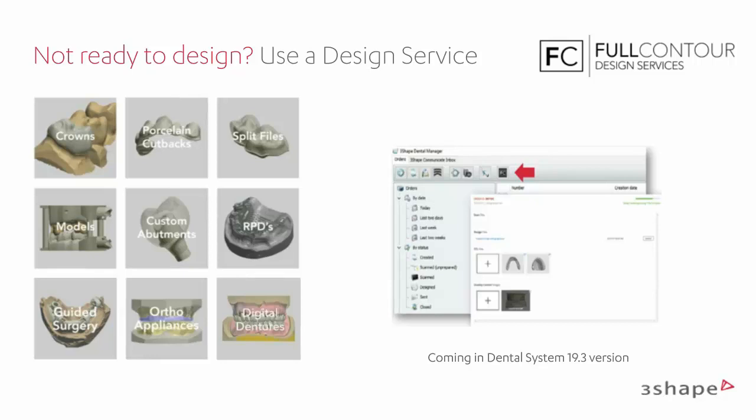When milling the bite with the virtual articulator, can you control the lateral movement? For example, milling a single upper denture with class 2 deep bite. I believe you can do this, but I need to confirm. Can you control the lateral movement? Yes, in the virtual articulator, you can control all the different movements.